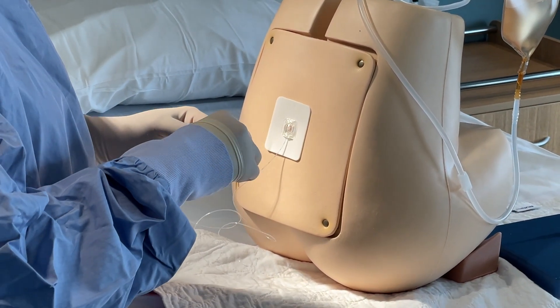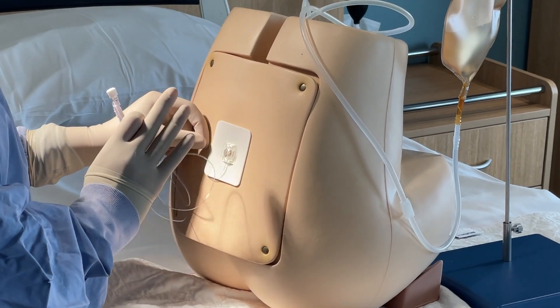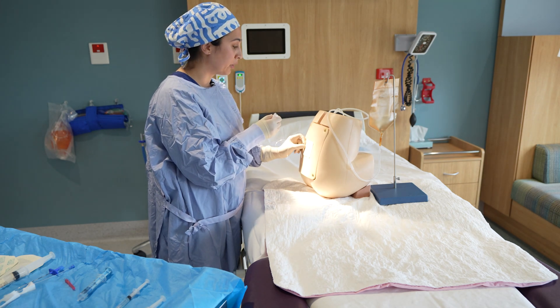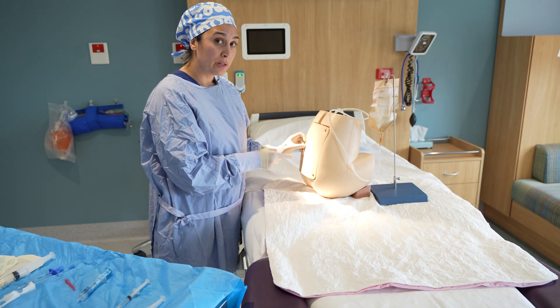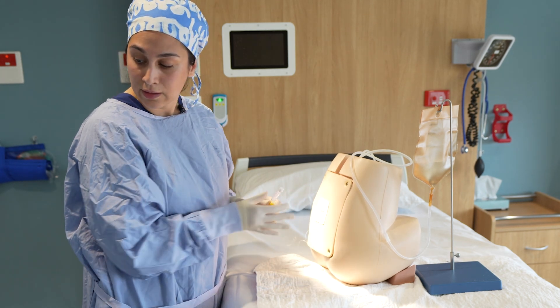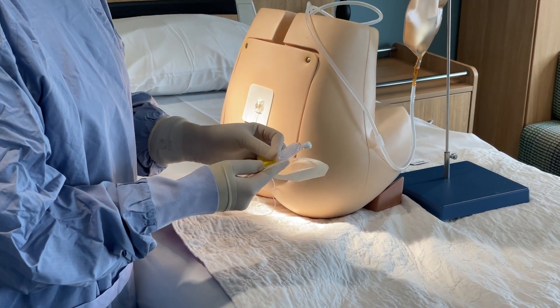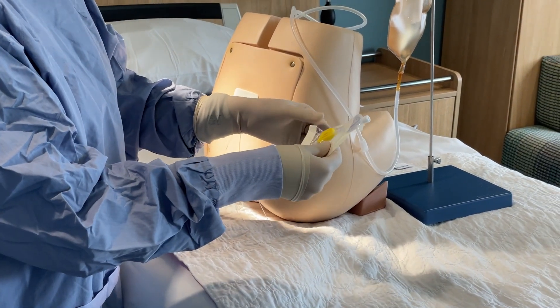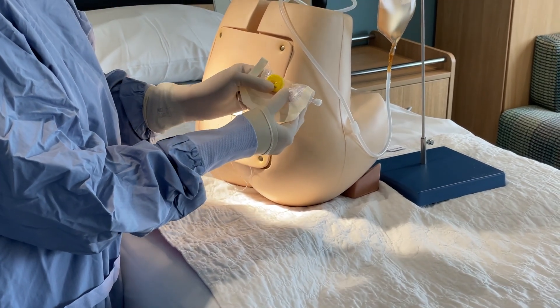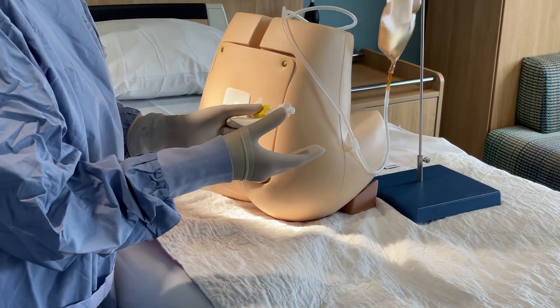Once the test dose is done, make the dressing look neat. Apply a small tegaderm followed by a large tegaderm, and ask the midwives which shoulder the epidural should exit from. They will provide hyperfix to create a window around the epidural dressing and across the shoulder to keep it in place. Also apply a tegaderm around the filter to discourage disconnection between the yellow connector and the filter, which can breach sterility — particularly important if the epidural is needed for an emergency top-up.